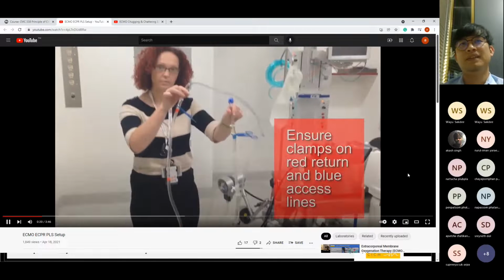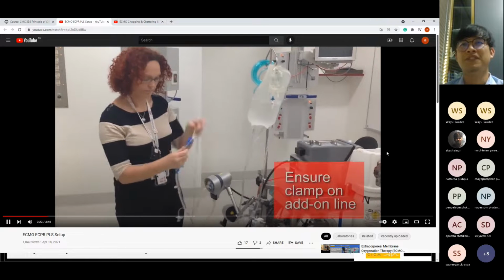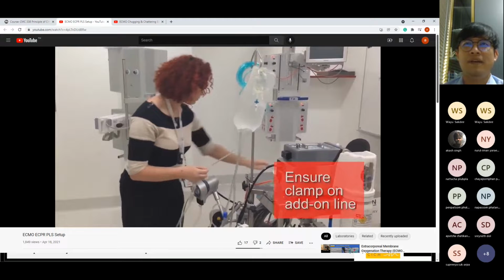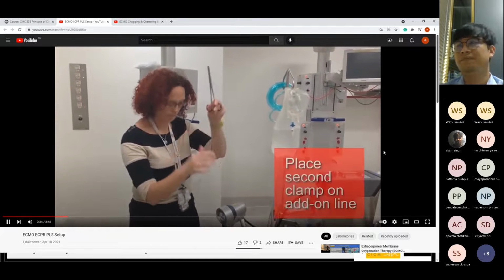You don't need to understand it now because it's quite complicated. If you have a chance to perform it yourself on the real machine, you're going to understand much more, and you can go back and repeat this video clip again. So for this time, we just show you how they do a priming, right? So here is a clamp.